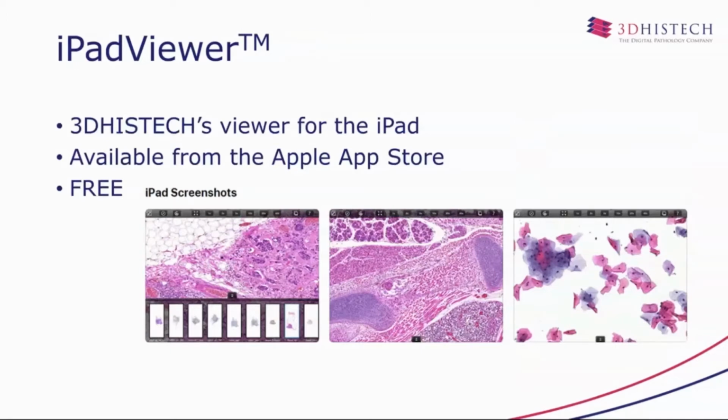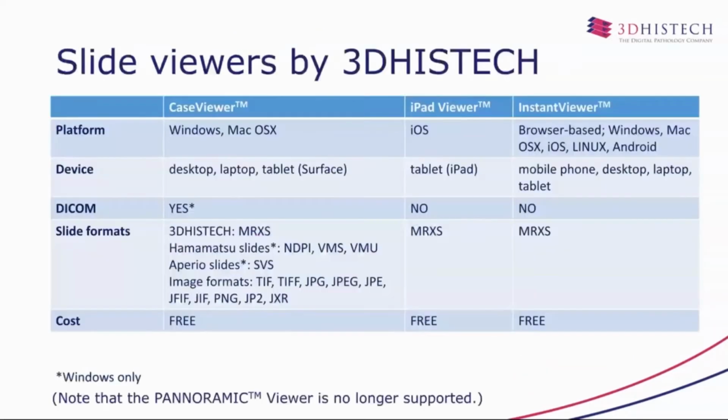For iPad users, we have a special iPad viewer for opening our digital slides. It's available from the Apple App Store, and again, this is also a free software, so you can download it without making any payment.